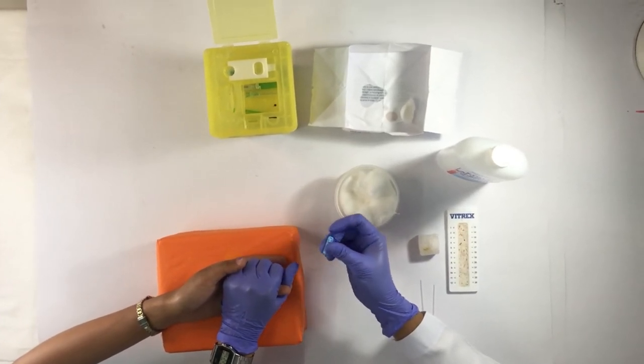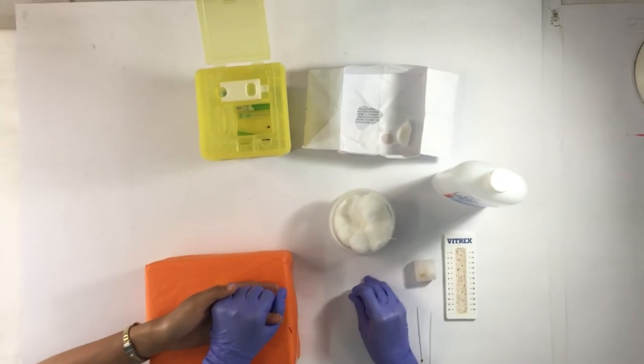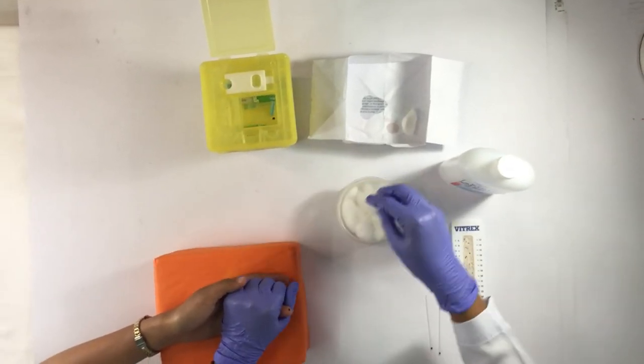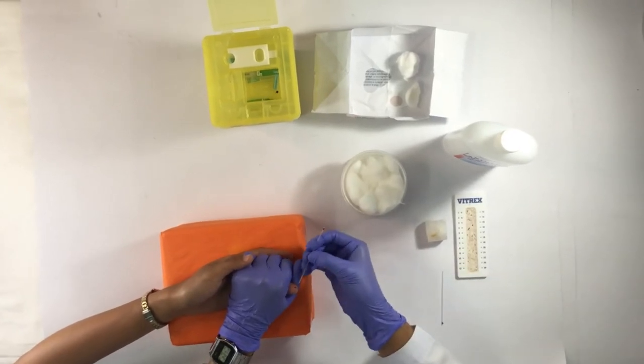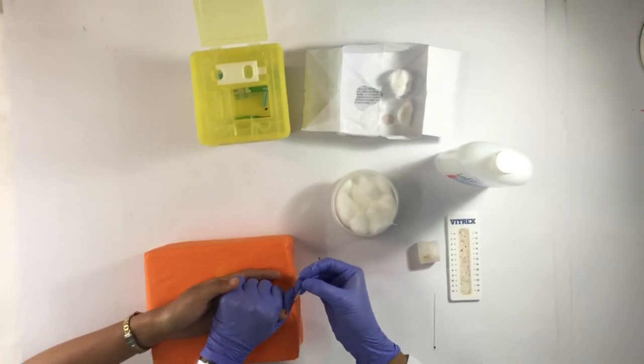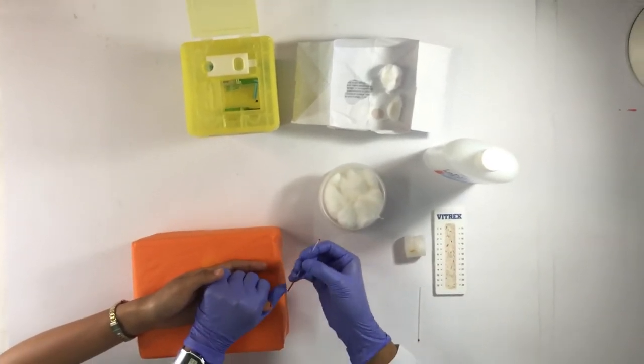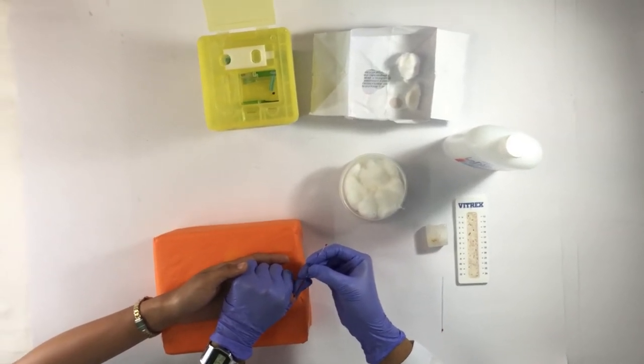Hold the finger of the patient and perform a quick, firm stab on the finger. Immediately discard the used lancet into the sharps container and wipe the first drop of blood using cotton. Make sure that the puncture site is perpendicular to the ridges of the finger to ensure that a ball of blood is generated for easy collection.